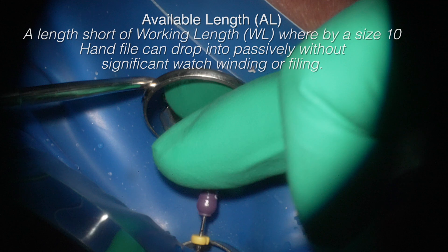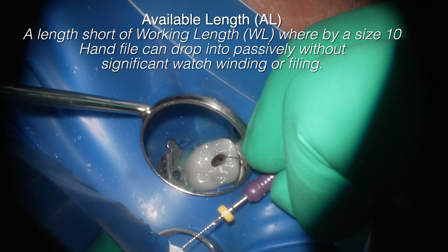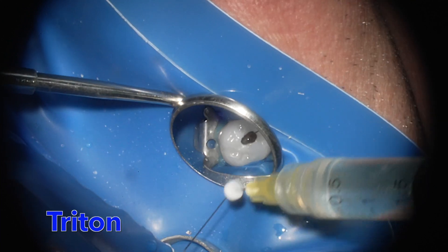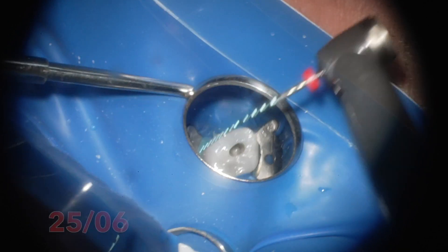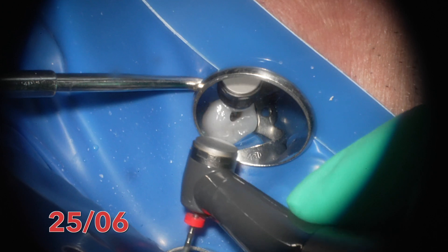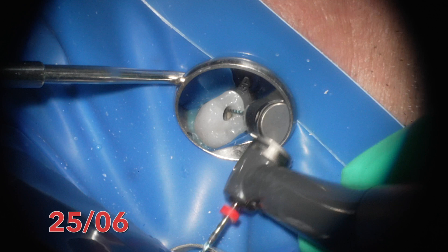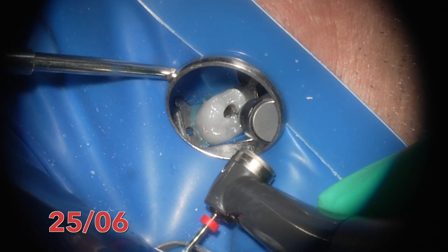I'm using a number 10 hand file with what I call the available length method — a stainless steel file that tells me how much available length I can instrument coronally in a crown-down technique safely. I'm using Triton now, which contains both decalcifying and chelating agents as well as disinfectants, before using the screening file — the expediter. You can see it's getting engaged with a couple of curves, so I'm using it in MB1 and MB2. The ESRCM uses counterclockwise cutting direction with a reciprocation action.